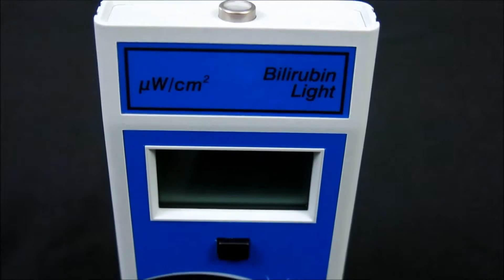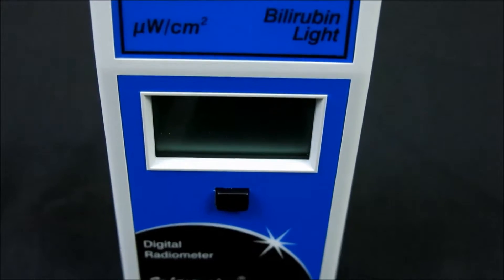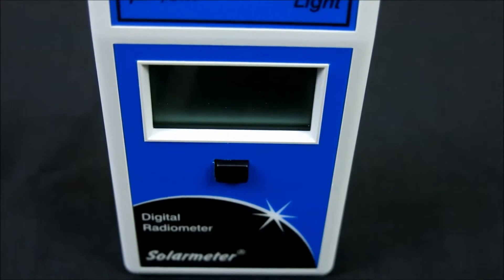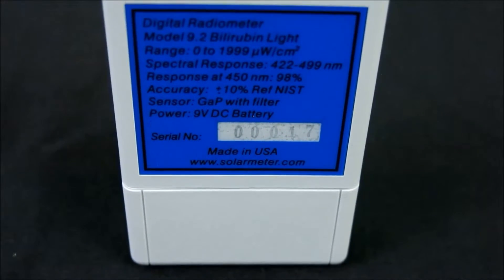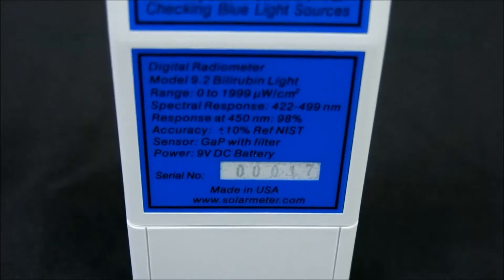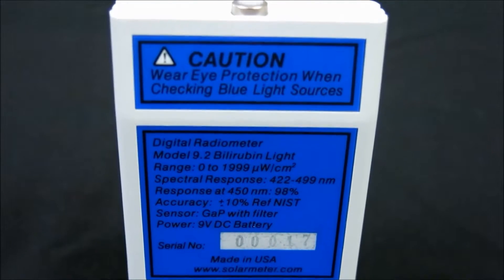The NIST traceable Model 9.2 features an irradiation range of 0 through 1,999 microwatts per centimeter squared blue light, and a response of 422 to 499 nanometers with a resolution of 0.1 microwatts per centimeter squared.